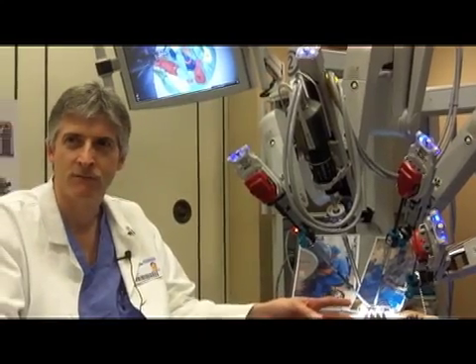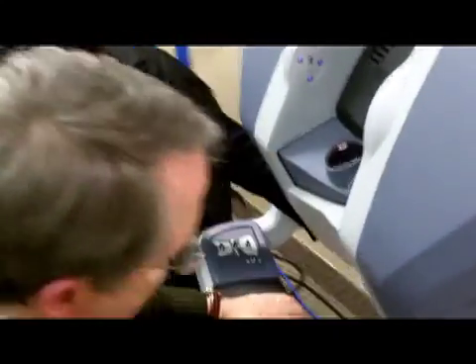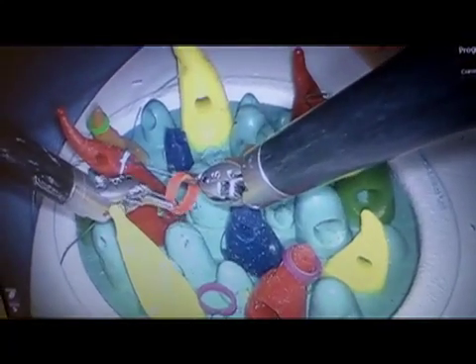This demonstration model allows us to exhibit how the robotic instruments function and allows whoever sits at the console to see the beauty of the three-dimensional field that the robotic system affords us.